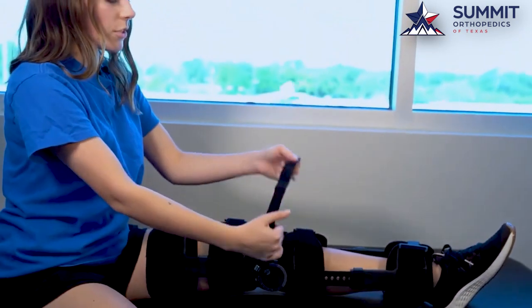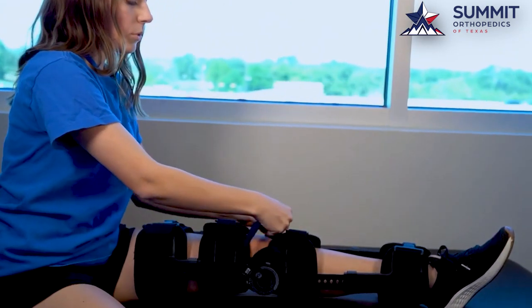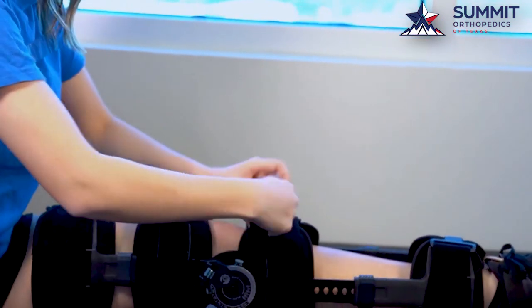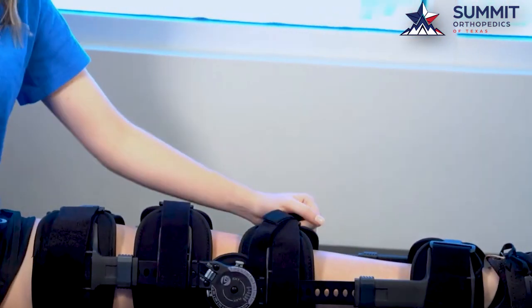The last strap you'll do is your assisting strap. You slip it through the top. It doesn't have to be done tight. It's just to help you lift your leg after surgery.